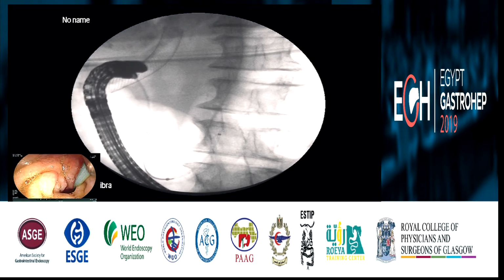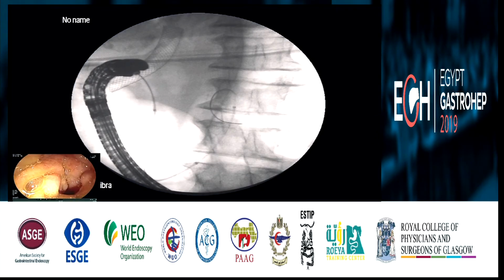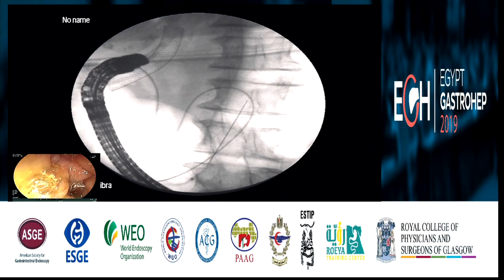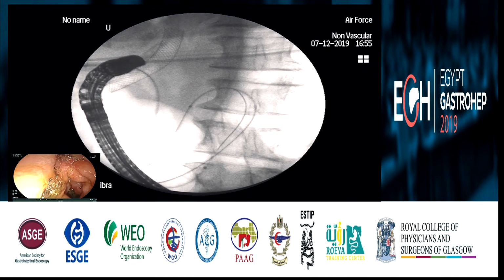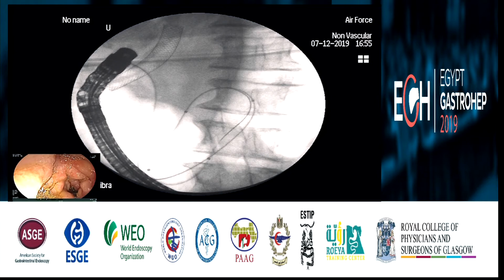So we are just like we began. Push, push, push. Do you have resistance? Are you good? That's better. So, yeah, it's okay. That resistance is okay. We're going to loop the wire. There's a little bit of resistance. We're going to create a few loops to prevent dislodgement during catheter exchange. I'm going to exchange the catheter that I used for guide wire passage. It is an 8.5 French Oasis stent introducing catheter.